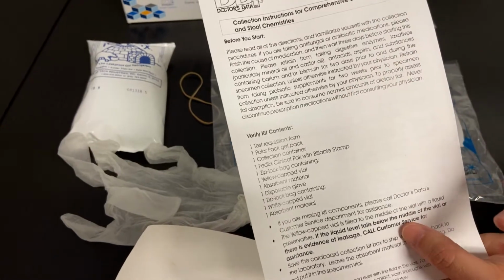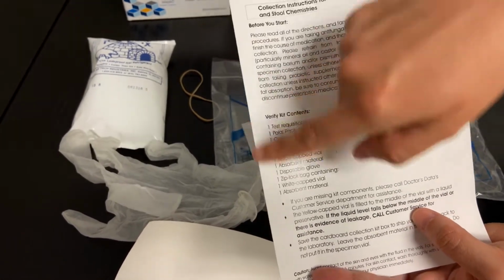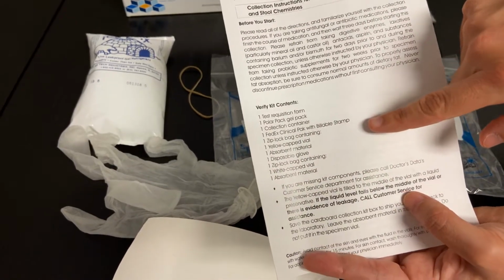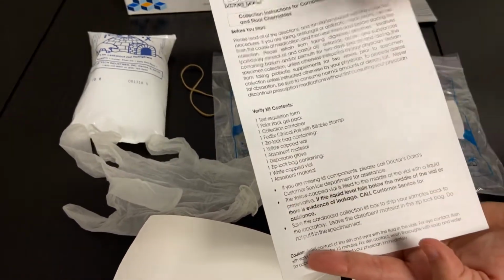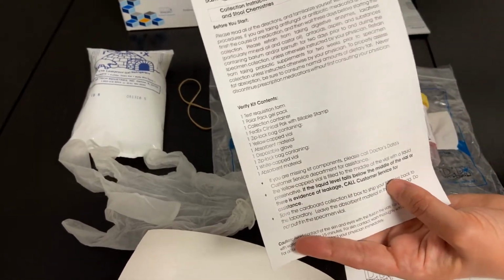So make sure that you get a good read through that to make sure what you need to do in order to prepare, and verify the test components that are included within your packet. There's also some additional information as far as, if there are any issues with the vial, to contact the company. But I will go through those as we start to discuss how to collect this.